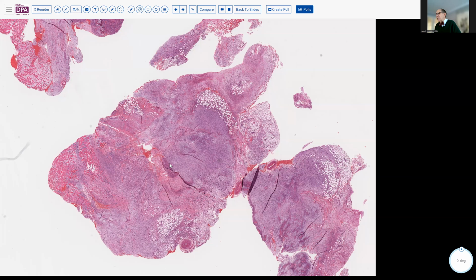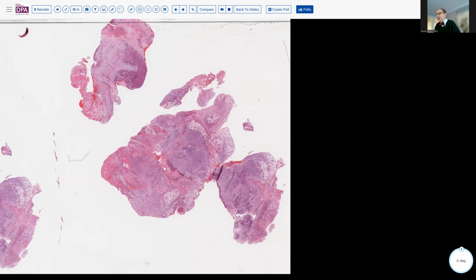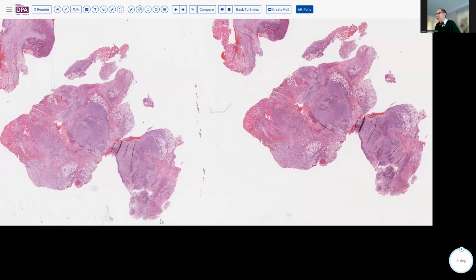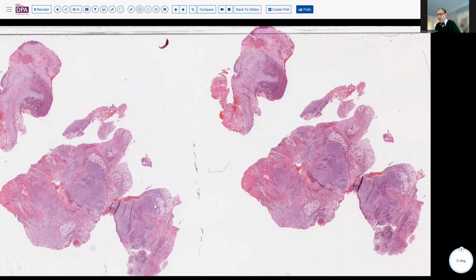The differential diagnosis usually is with malignancy, but with the very low-grade cytology and the zonation, we're not usually going to be thinking about soft tissue osteosarcoma or extraosseous osteosarcoma or something like that. So those are a couple of cases that I thought were an interesting differential of a mixture of biphasic tumors with bone and myxoid areas and spindle cell areas as well.